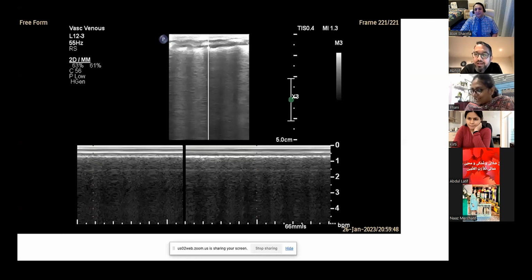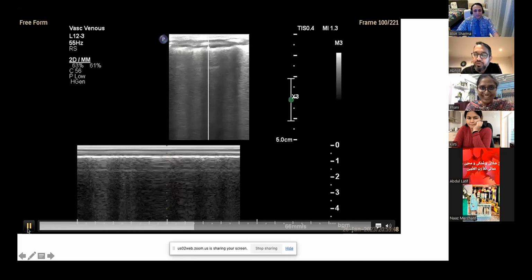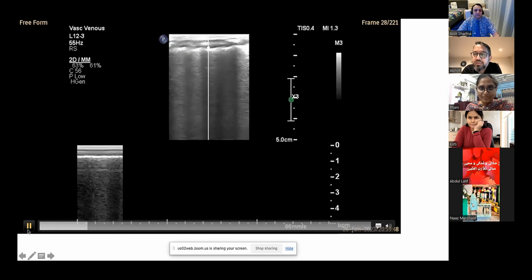One more thing I would like to add for all the participants. When we are presenting it, if we can keep the video on the loop, it becomes easier to interpret, because it runs for half a second or so. So it really becomes difficult. So if you keep it on a loop, in a slideshow, it becomes easier to interpret the images.